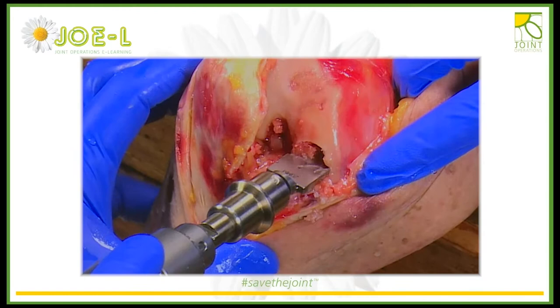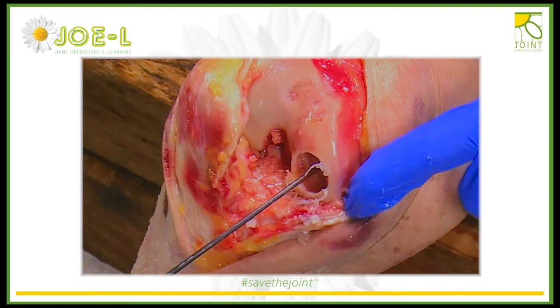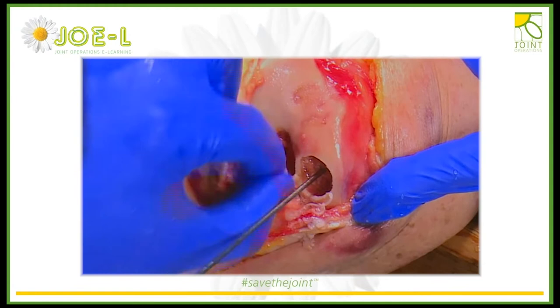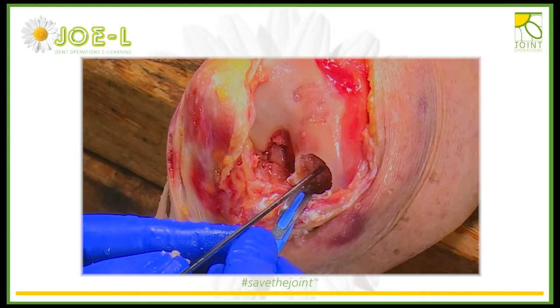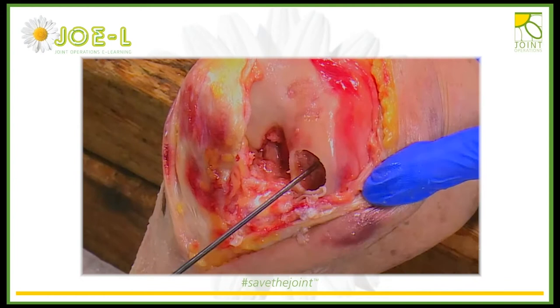That measures about 8mm on there, so that would be okay. You pull around and just cut that to make a nice defect. In terms of ordering a pre-made plug, 16 millimeters is the largest that they currently do. Above that you need to go into size matching, because once you get above 16mm you need an appropriately matched donor so that the radius is the same.